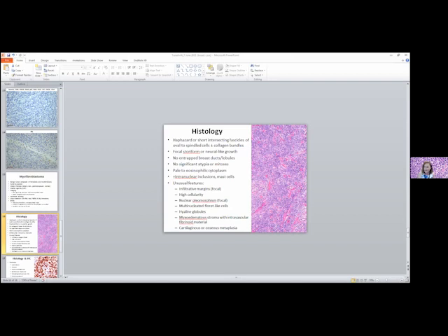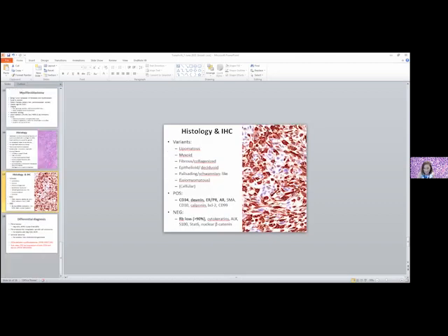We can have high cellularity, and arguably this case had somewhat increased cellularity. Sometimes we can see marked nuclear pleomorphism, but it shouldn't be diffuse, though focal pleomorphism is acceptable. We can see some multinucleated cells or hyaline globules or marked myxoid change, and even some osseous or chondroid metaplasia in some cases.